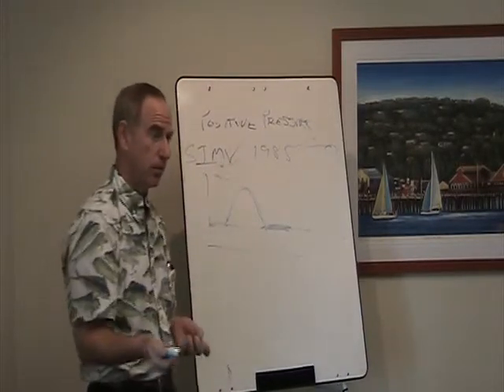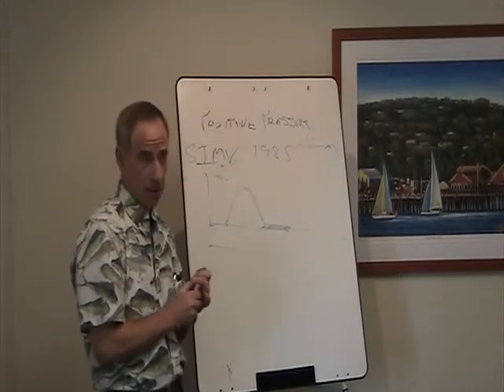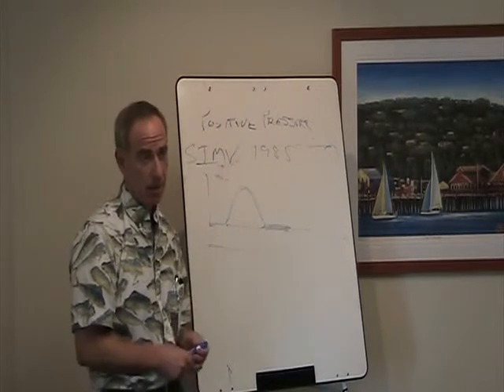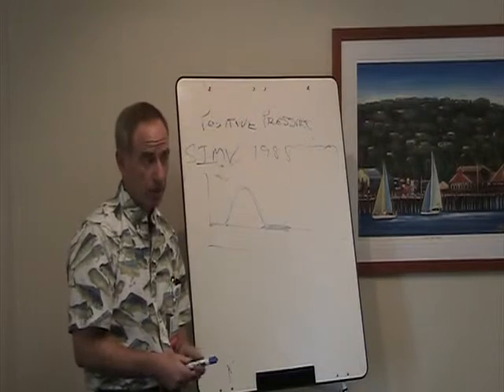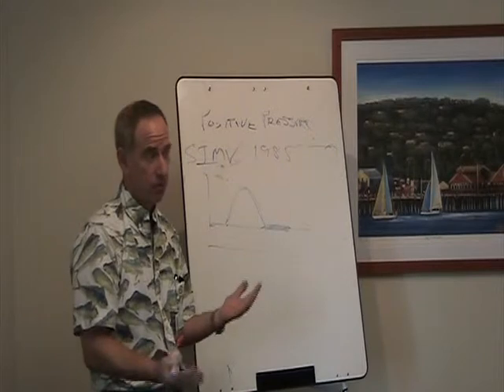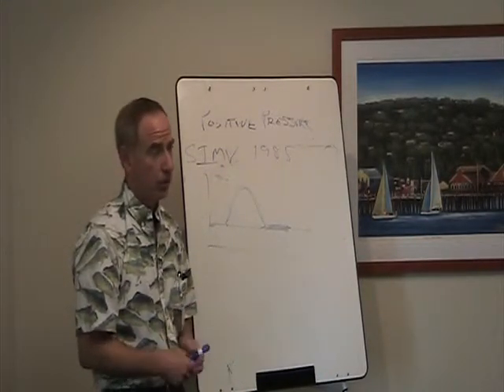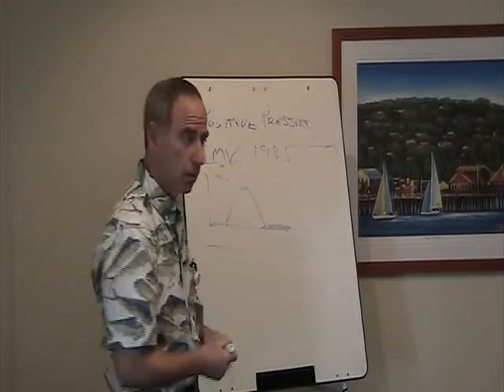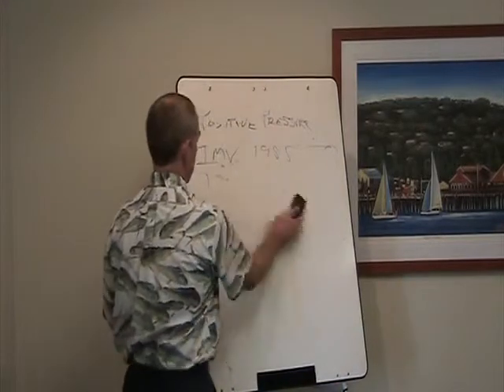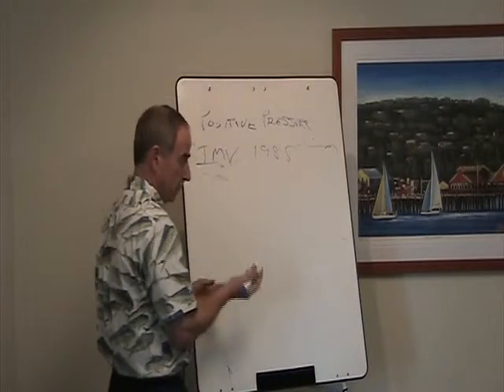In fact, on a lot of ventilators, the setting for PEEP and CPAP is the same button because it's really the same thing. It's really just a matter of whether the patient's breathing spontaneously or getting mechanical breaths. That's the main difference between the two terms. So you should think of them as almost equivalent in terms of the effect that they have on alveoli and on alveolar recruitment. Okay? So PEEP and CPAP are not modes of ventilation, but they were developed in the 60s.